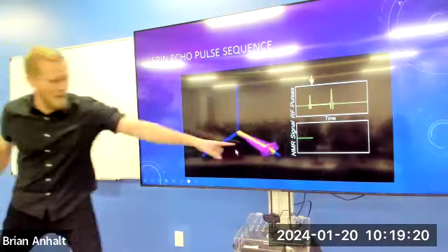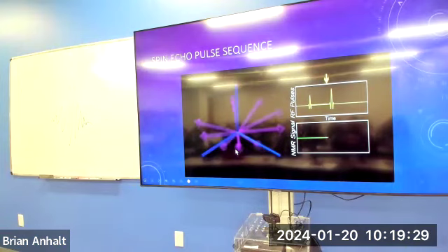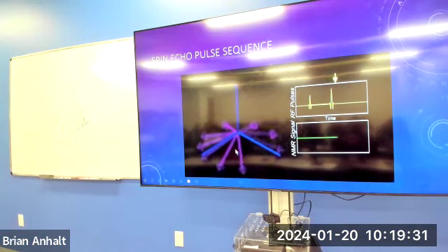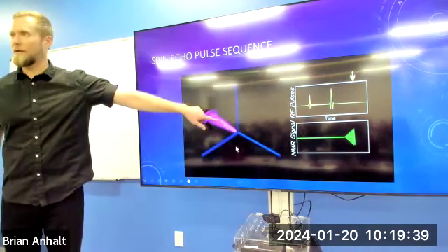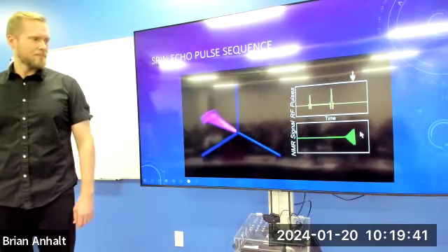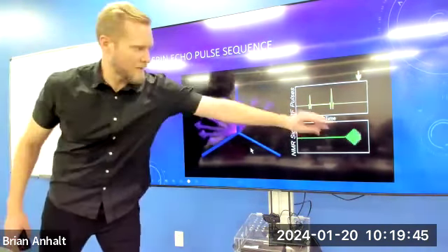At the beginning, they are perfectly in phase. Everything starts to decay away, so they're out of phase. So if we measured at this time, we'd see the signal diminishing. They get out of phase, it tends towards zero, and then we flip them around the other way. In the rotating frame of reference, the fast ones catch the slow ones, and there we go. That's sort of bada bing, bada boom, they refocus, though not perfectly, right? And we measure now, the signal comes back. And if we let it go further, the signal diminishes away again.